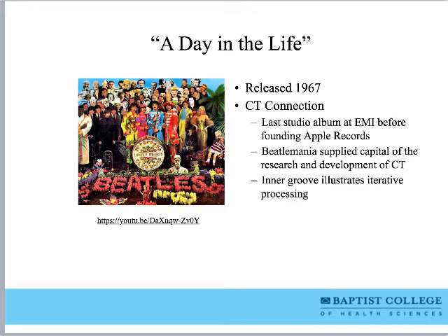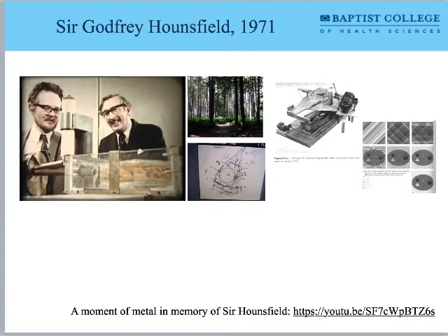It was indicating that now we're using an iterative reconstruction reformat. We're using a mathematic process that just repeats infinitely until it has a perfect picture. We borrowed it in part from nuclear medicine. So around 1971, we have the first prototype CT scanner transitioning into actual medical use.